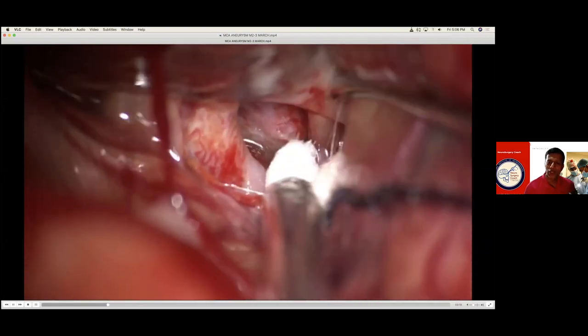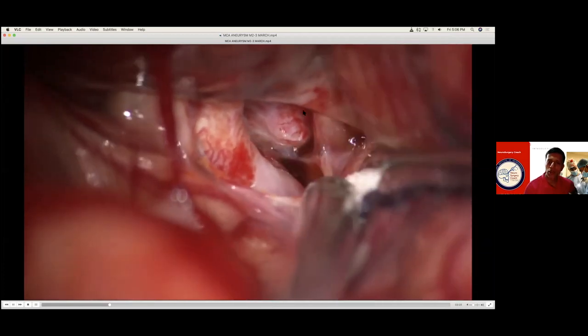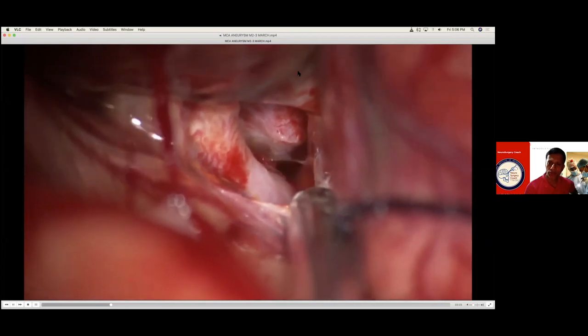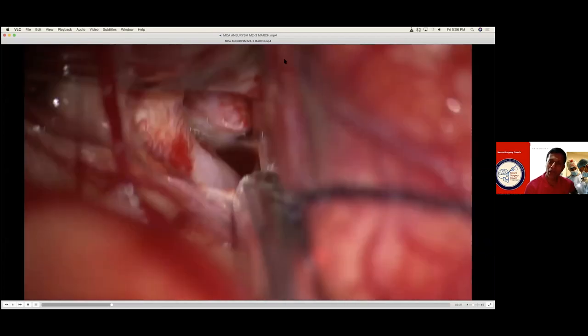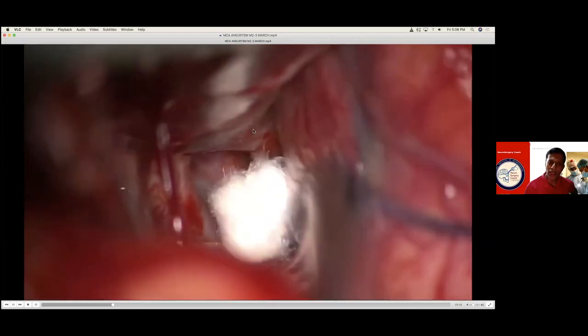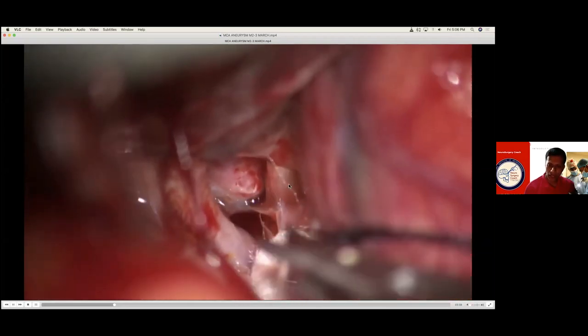That's a posterior clinoid — something I would have drilled if this were a basilar aneurysm. This size of a posterior clinoid would not be very acceptable for me; I would have incised it and drilled it to get a beautiful window. That is a third nerve, and the third nerve is getting into the oculomotor trigon there. That's the cavernous sinus roof. We've seen many paracavernous paraclinoid aneurysms where we incised this and got the C3 carotid.